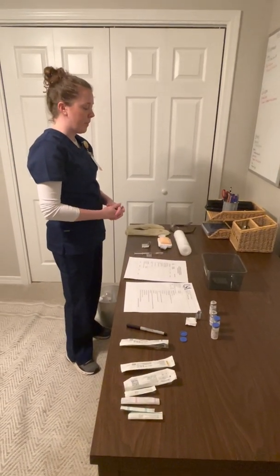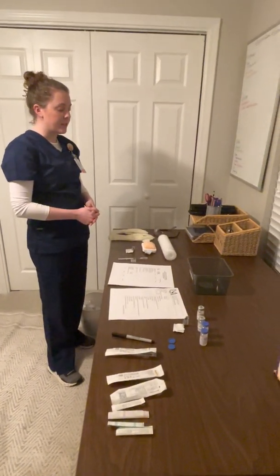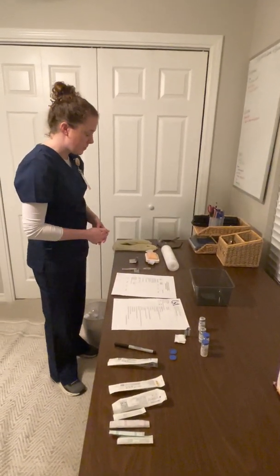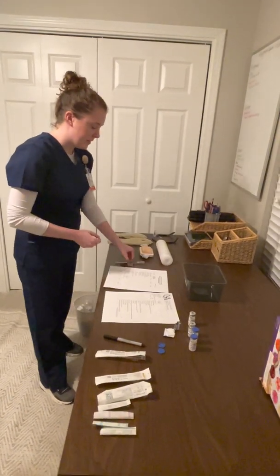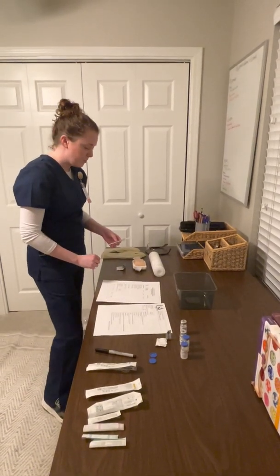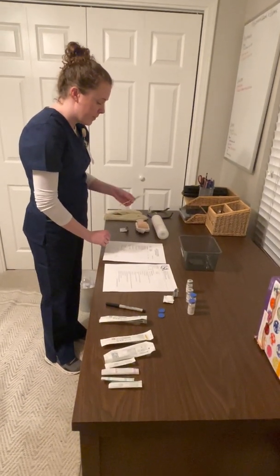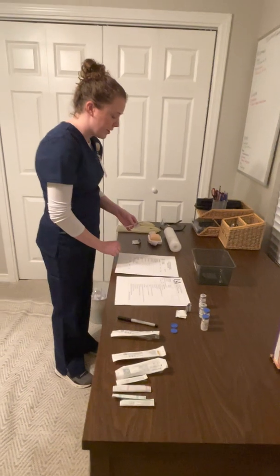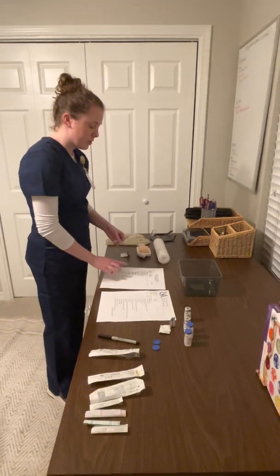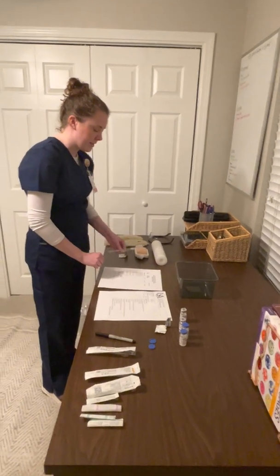I would then also do any type of pre-administration assessments to the patient, such as checking their blood pressure or their pulse. The next thing I would go ahead and do is compare my syringe to my MAR using the 5 rights. So today we have the right patient, which is Jaguar J. Jones. We have the right medication, which is heparin. We have the right dose, which is 5,000 units or 0.5 milliliters of heparin. We are doing this injection subcutaneously, and we are doing this injection every 12 hours, which is the right time.